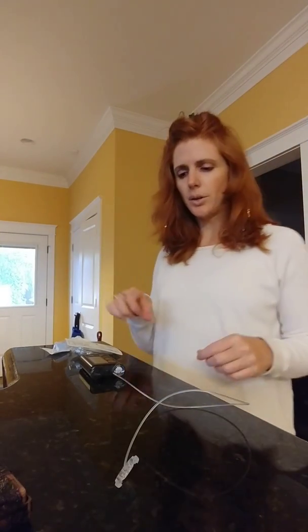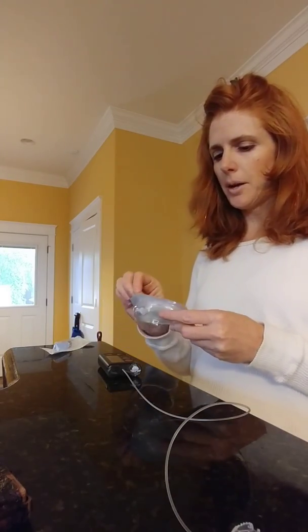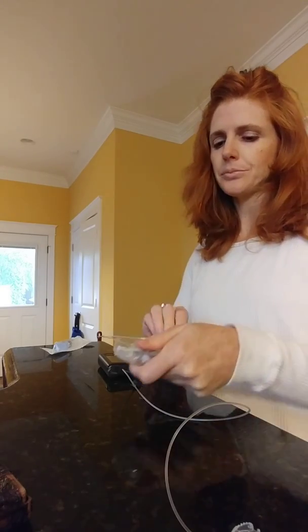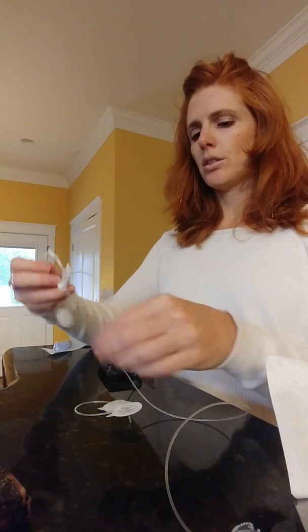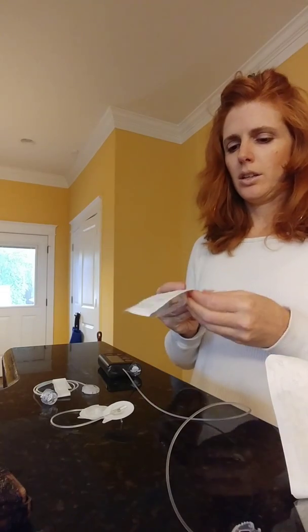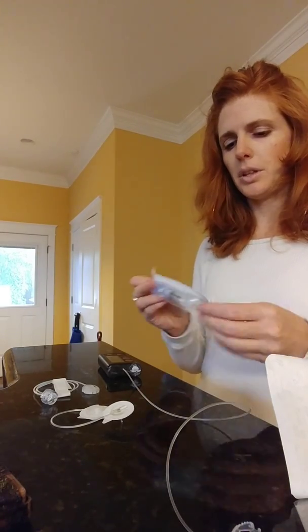Okay, just a quick video of how to do the Medtronic site change. So I've got the Shorty Paradigm, which is actually going to include the site as well as the tubing here. And then I've also got the MiniMed reservoir, and that's what I'm going to actually draw the insulin with.